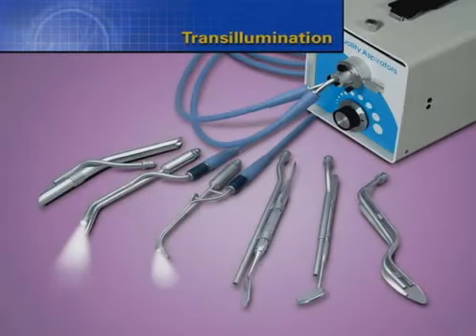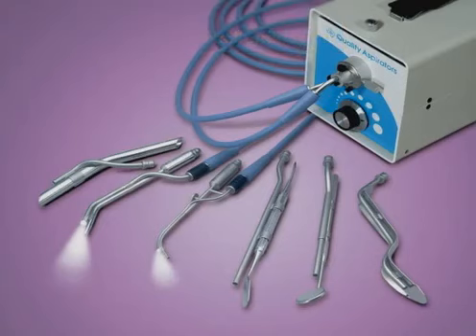Transilluminating devices are an important adjunct to good vision. Dental auxiliaries need to be trained to hold the fiber optic wand either above or below the rubber dam to play the light buccal to lingual to enhance vision. With the overhead light and the microscope light both turned off, transillumination gives us a wonderful perspective of the MB1 and related groove in this maxillary first molar.